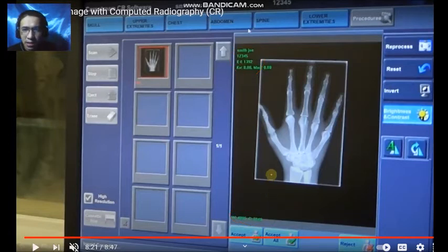But in this image, I guess there is no indicator of the exposure indicator. This is the name of the patient. This could be the ID marker of the patient. I don't know what this is. Okay. And then most commonly, the indicator of how much exposure was received by the imaging plate is usually indicated on this portion, either this or the other bottom part.